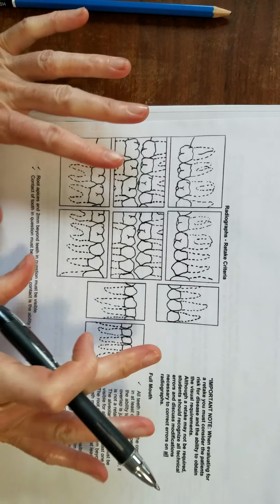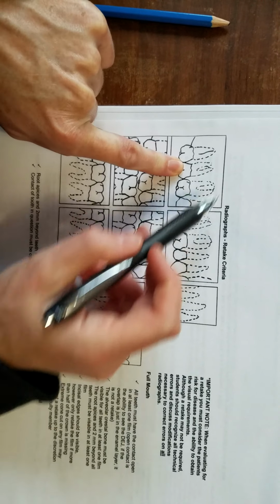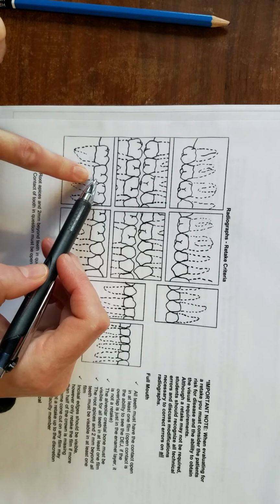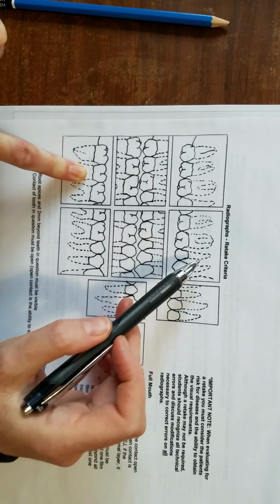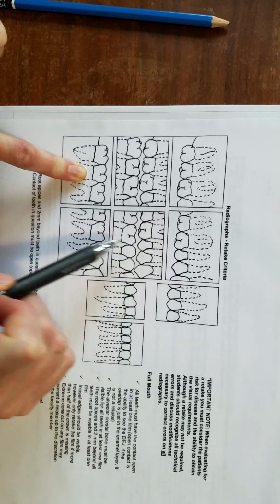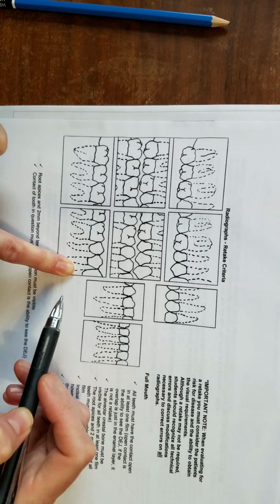study this sheet, and you have to start getting these memorized. So on all molar films, you always want the second molar to be centered on the sensor. So you can see that pretty close, the second molar is centered on the sensor. Now, sometimes when you put it that far back so that the second molar is centered, you won't get all of this anterior, but it's okay because you'll get it in your premolar shot. So you might cut off the mesial of the first molar in all of these pictures. You may or may not. It depends on the patient's size of their teeth, but you will see them in the premolar shot, so it's okay. So just think about that criteria for your molars, the distal of the canine for your premolar shot. That's one of the big criteria there.